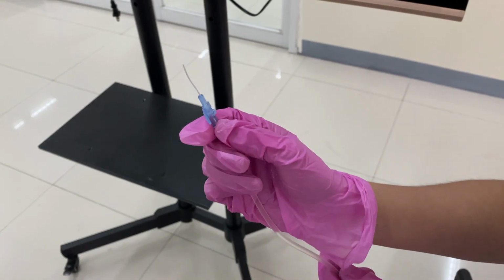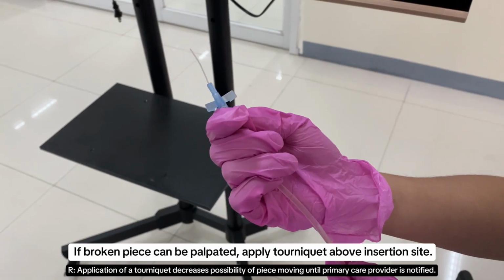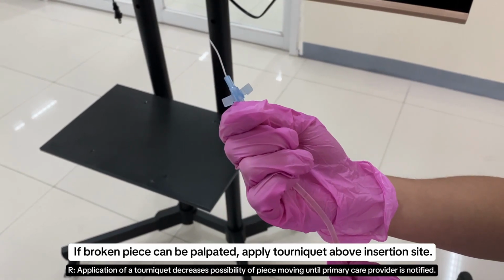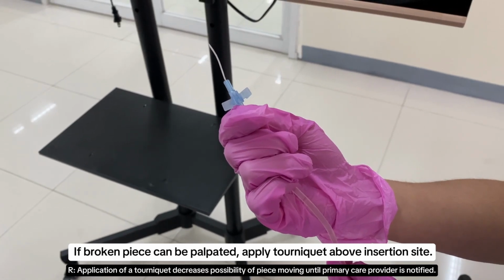If the broken piece can be palpated, apply a tourniquet above the insertion site. Application of a tourniquet decreases the possibility of the piece moving until the primary care provider is notified.